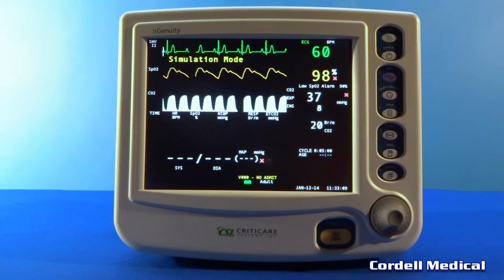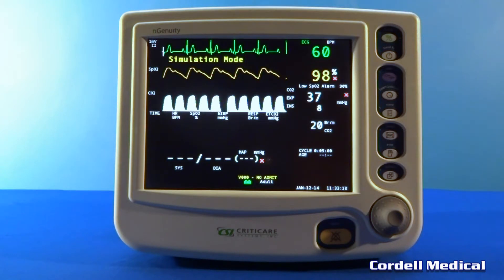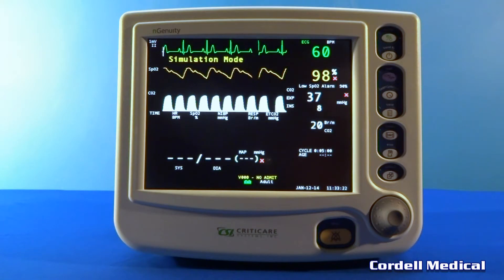This monitor has an easy-to-read 10.4 inch color screen, monitors ECG, SPO2, heart rate, temperature, respiration, measures NIBP as the cuff inflates, and monitors capnography with sidestream technology.